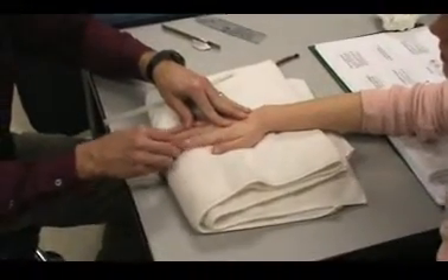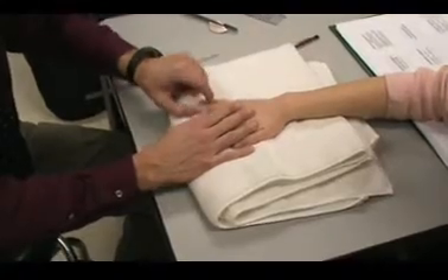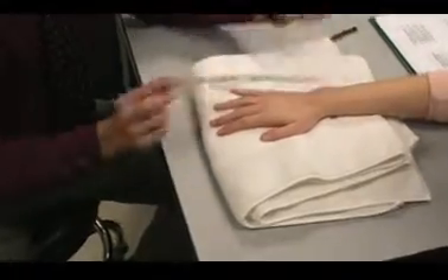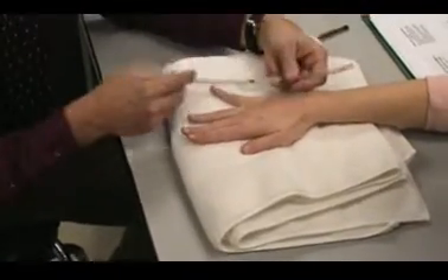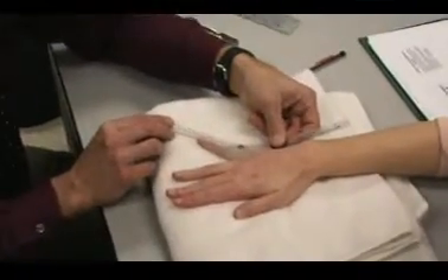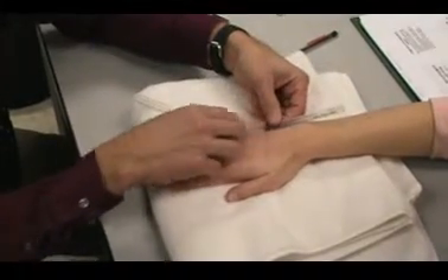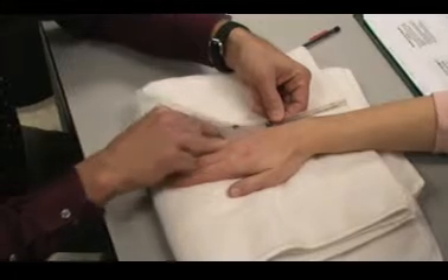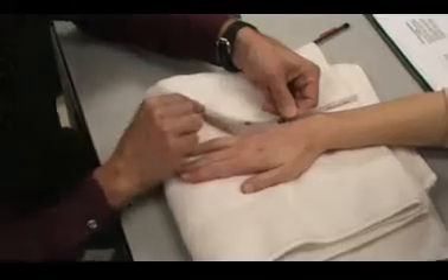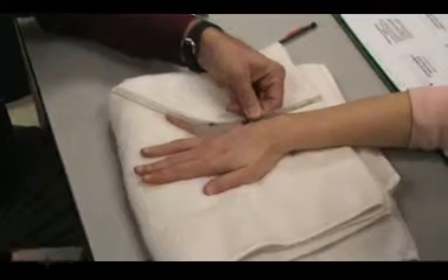So 2, 5, and 4 can abduct. Let's do 5. I'm going to be over the dorsum of the MCP joint for my axis. I'm going to line up along the 5th metacarpal — the dorsum of the 5th metacarpal — and then I'm going to be over the dorsum of the proximal phalanx of the 5th. And I have 0 to 30 degrees of abduction.